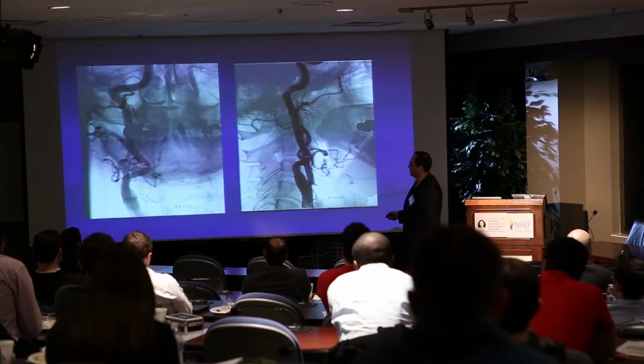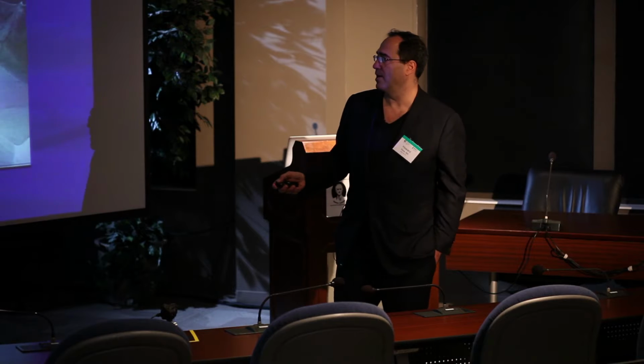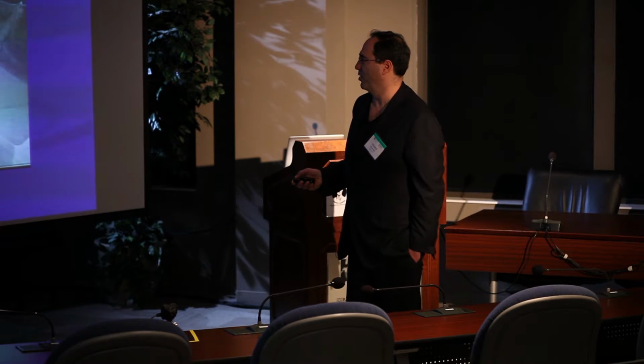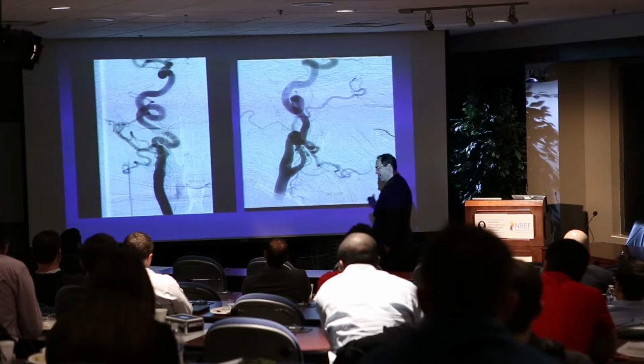So you can see, some things you may miss if you don't rotate them, and that could cause a problem for you. And you may not even want to go beyond something like that right away, just for the diagnostic portion of your study. And then there are patients that have extreme tortuosity and things like that. So again, getting some information.